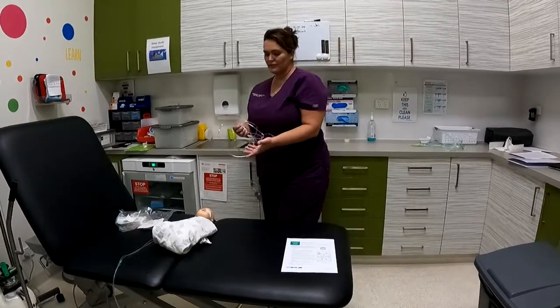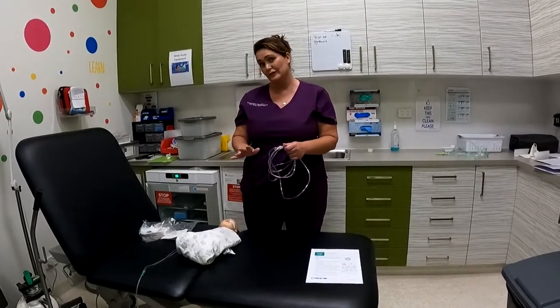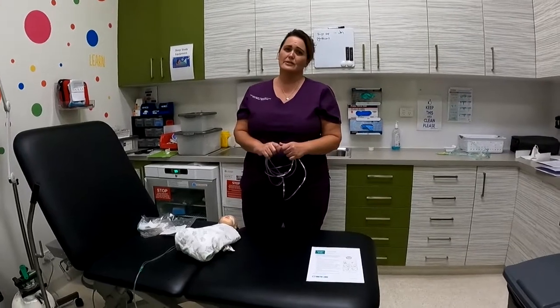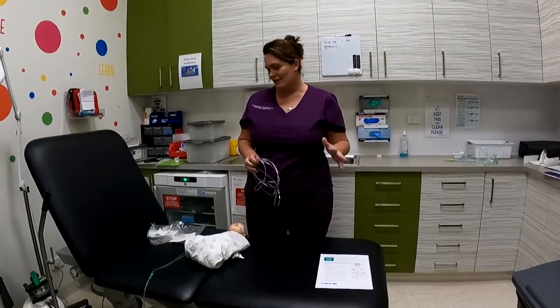And then once you've washed them and dried them, you can just pop them in a little Glad bag or something like that to keep them clean and the dust off them until you need to use them. Like I said, I don't spend a lot of time on that because it's very rare that you'd need to wash your prongs out. Most people find they've got more than enough.